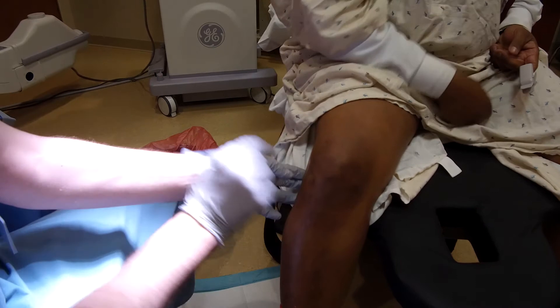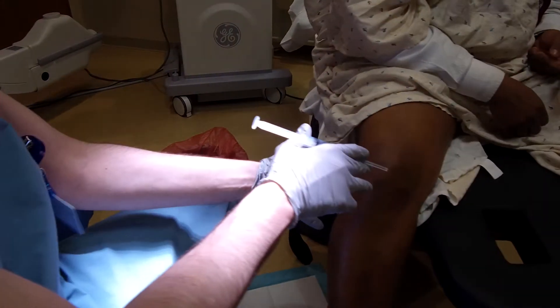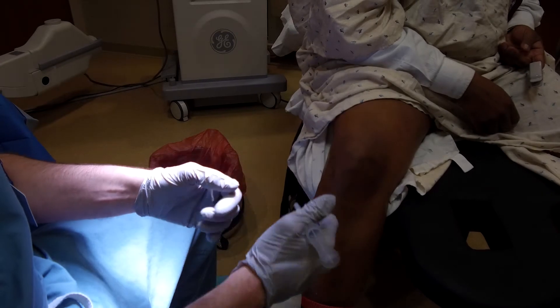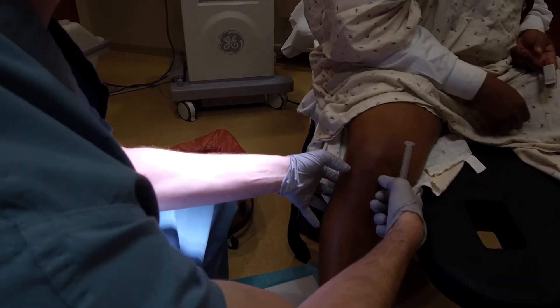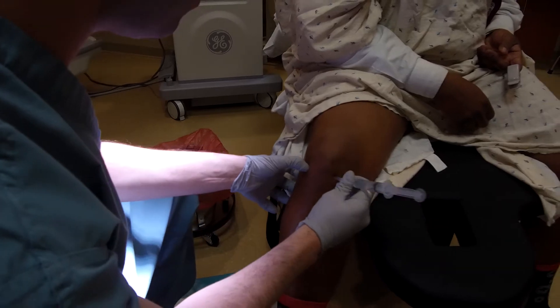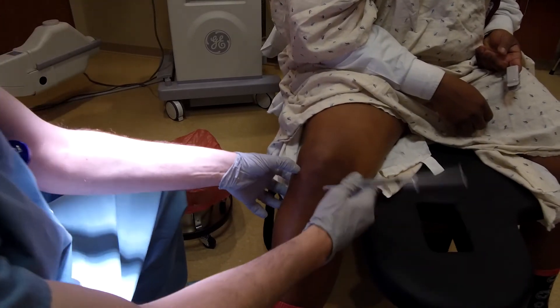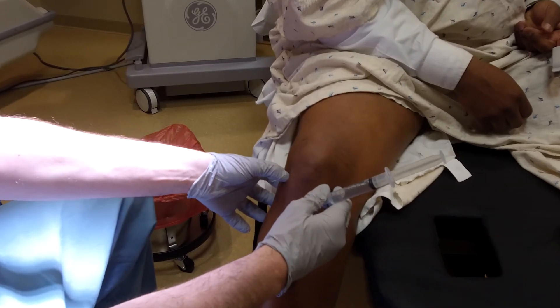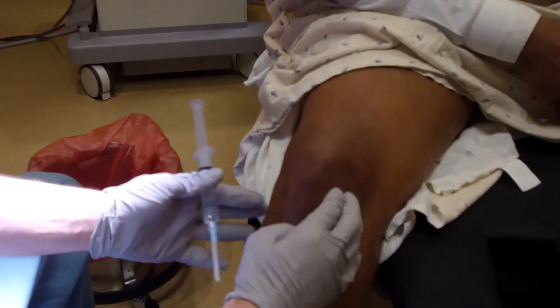So what I'm doing here is figuring out the trajectory of where this camera is going to go, so I can have a good look at what I want to see. Usually I try to look at both sides. For you, I'm most interested in the inside part of your knee because that's where you feel the most pain. Am I right about that? Doesn't that hurt you up in here?